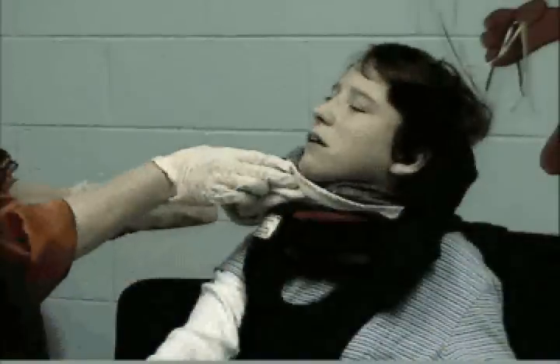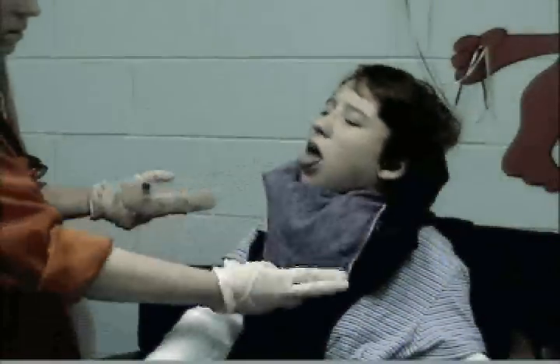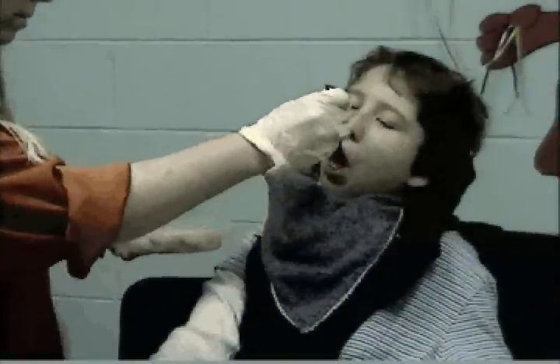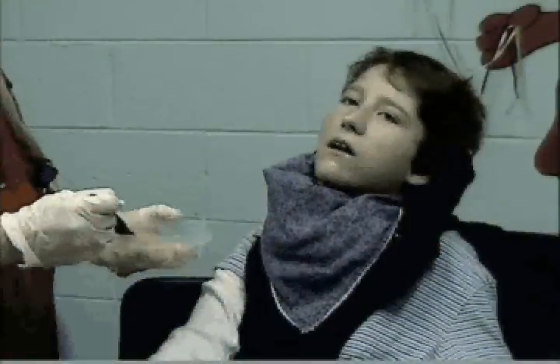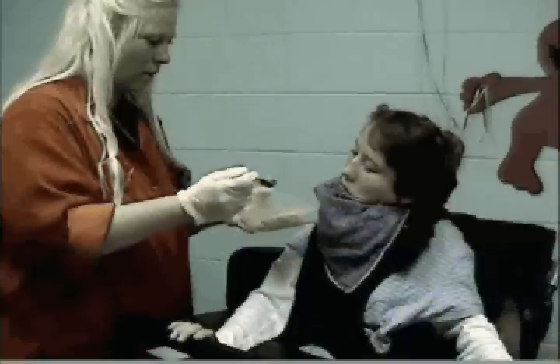Underneath the bib is the chin prompt — I'll raise that up so you can see it — and that's helping Leslie keep her head upright and in midline. She does really nicely with that. That was a nice swallow.